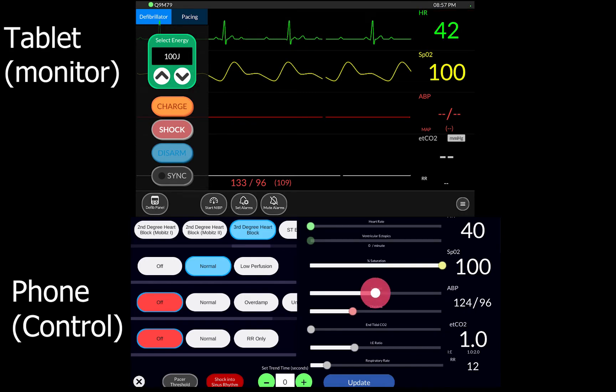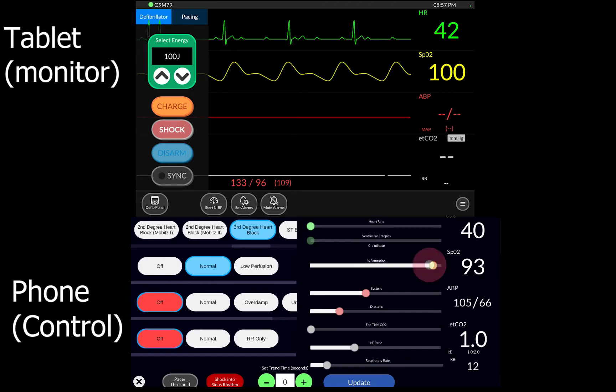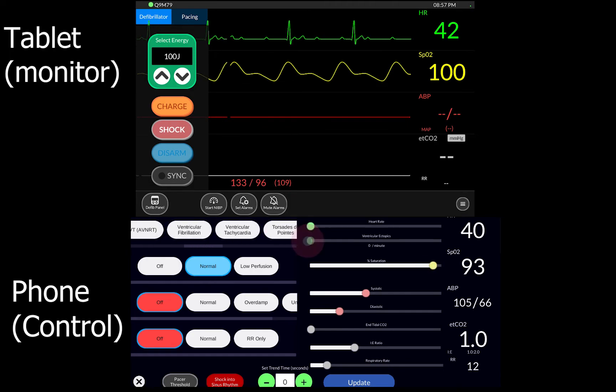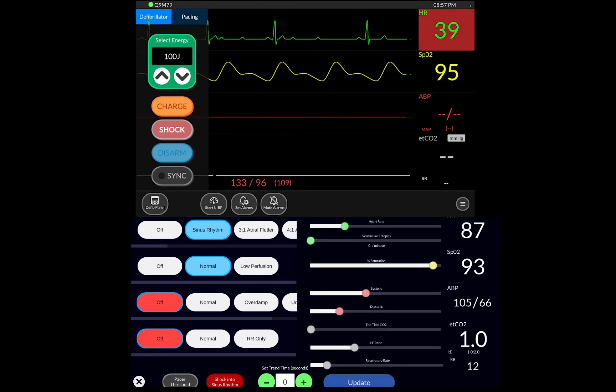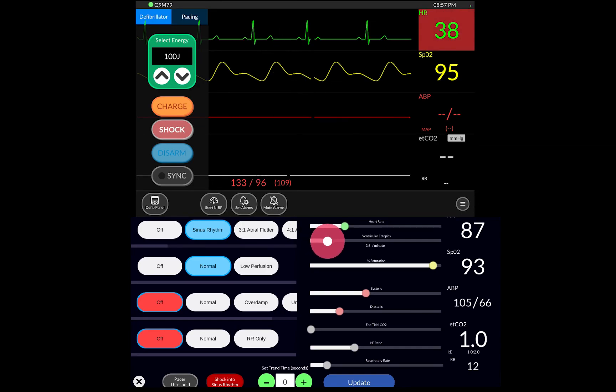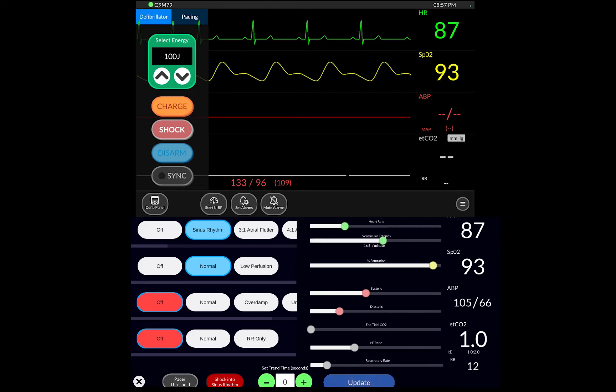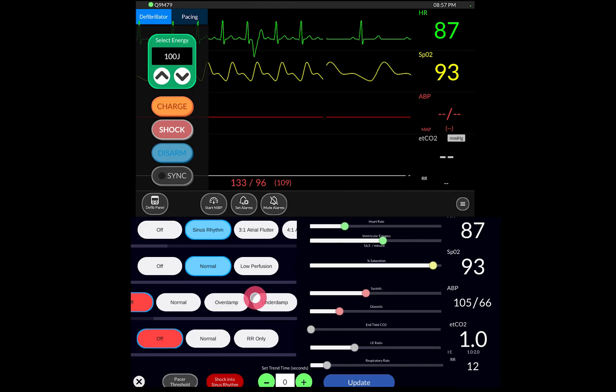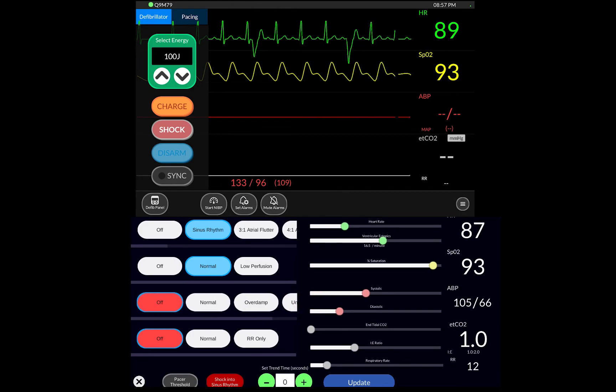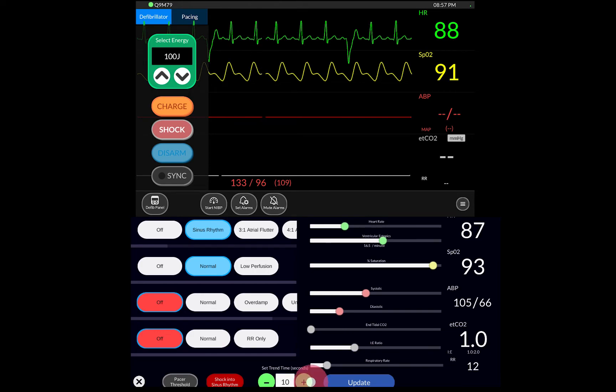So I can drop the blood pressure, I can drop the saturation and put them into a little bit better heart rate. And you can add ventricular ectopic beats here if you wanted to. 6 a minute or 16 a minute or whatever the case is to make it look different and got all these other options. So the only other thing I haven't shown you is that there is a set trends over time.